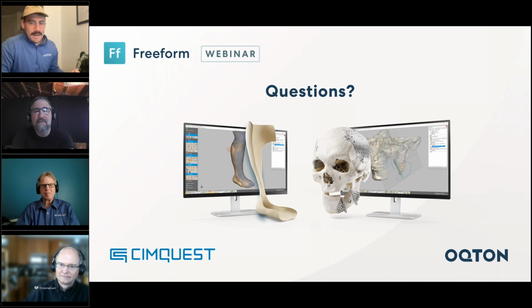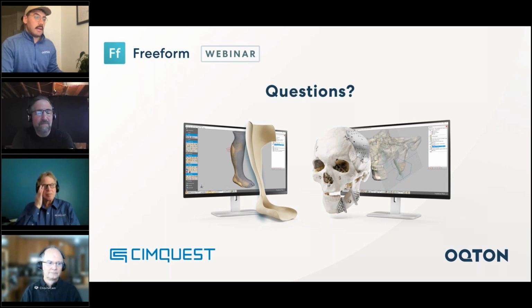We do have customers that have agreed to share their use cases. We have a number of case studies on the website, so if you want to learn more, not so much the blow by blow of how they're using the software, but what they are creating and how they are using Freeform in their workflows, then absolutely head over to the website. We'll make sure to include some reference information when we share the recording with you afterwards.